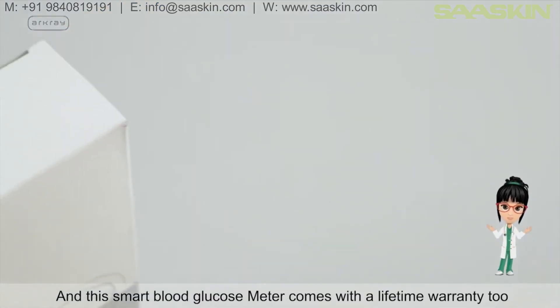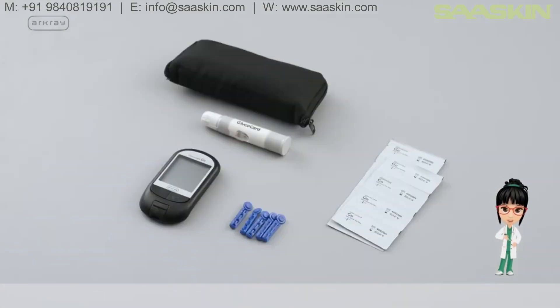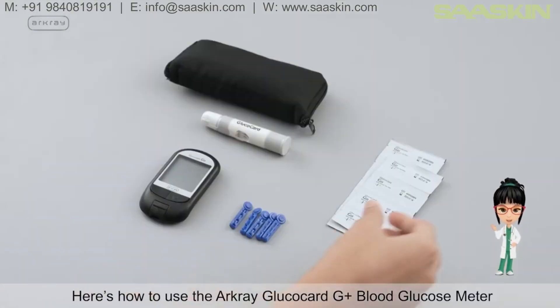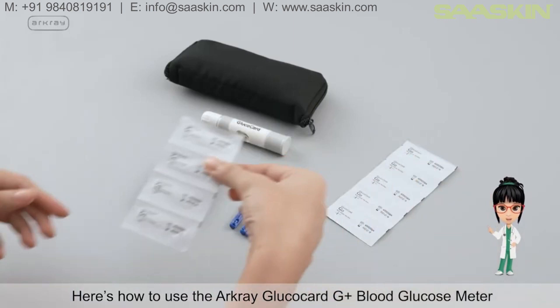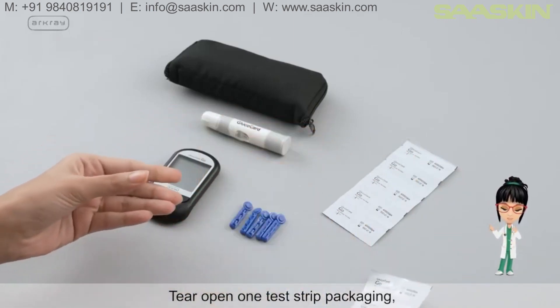This smart blood glucose meter comes with a lifetime warranty too. Here's how to use the R-Cray Glucocard G Plus Blood Glucose Meter: tear open one test strip packaging.